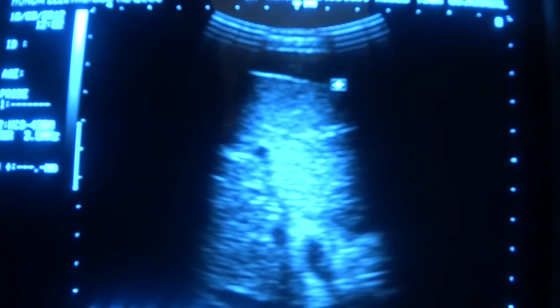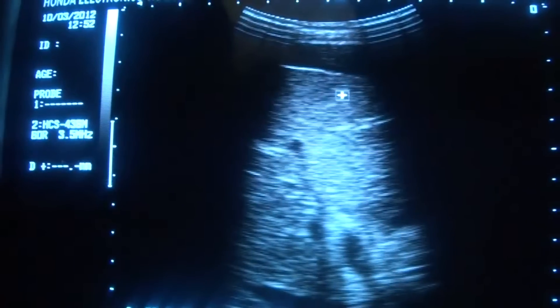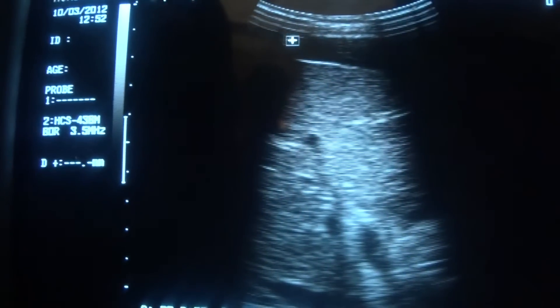And in doing so, you see fluid not only in the pleural cavity. This is the angle from where I got that view. Going up and downwards and magnifying, I can see fluid around the liver as well. This is the liver's outer surface, which is smooth. This is the parenchyma of the liver, which has normal echogenicity, and this is the fluid surrounding the anterior surface of the liver.